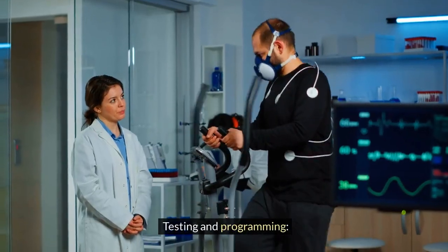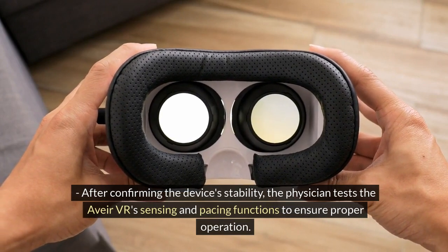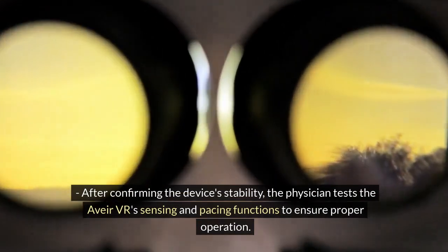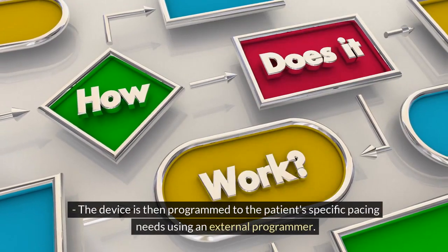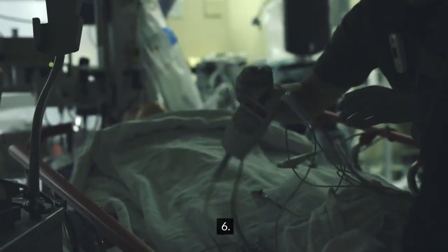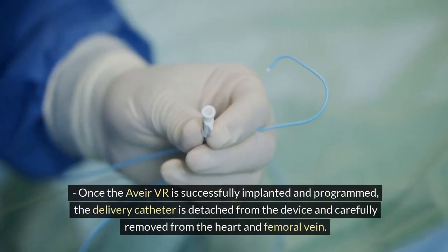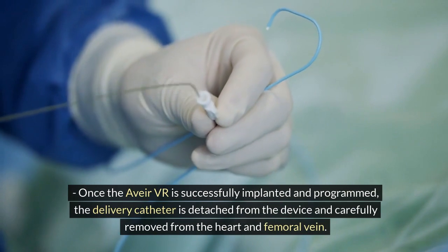Step 5: Testing and programming — after confirming the device's stability, the physician tests the Aveir VR's sensing and pacing functions to ensure proper operation. The device is then programmed to the patient's specific pacing needs using an external programmer.